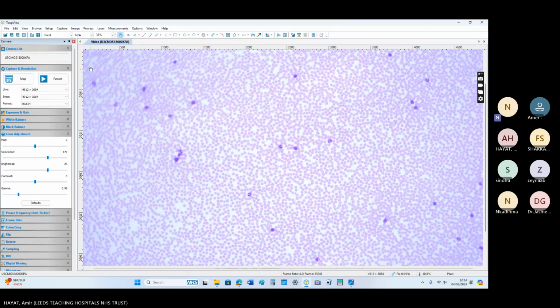But CNL will depend upon the age of the patient. We can't say CNL in a young patient. That's why it is one of the differentials, and you will exclude it on this basis that there is a myeloid peak in this film. Also, the neutrophil count is high, but they are not mature. And in leukemoid reactions, although the white cell count is high, there should be no basophils. So you will exclude it like this.